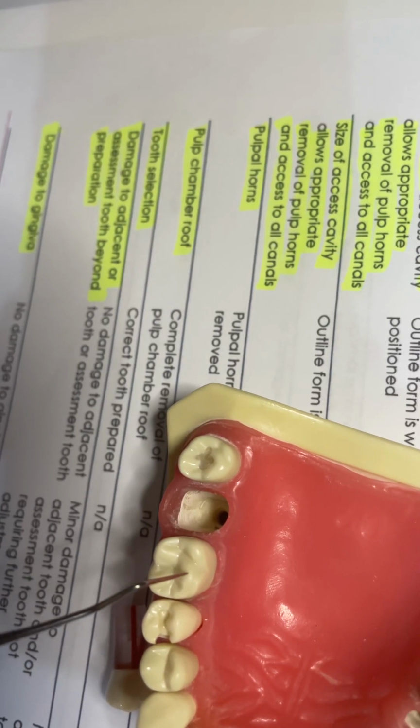And this is our oblique ridge or transverse ridge. So for the canal locations, we need to know the anatomy first, and then we need to know where our canals are located. Only then can you actually go there and punch it, otherwise you will be going blindly to where the canals are, and then you will be overextending.